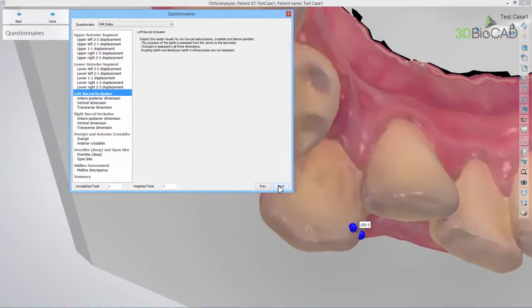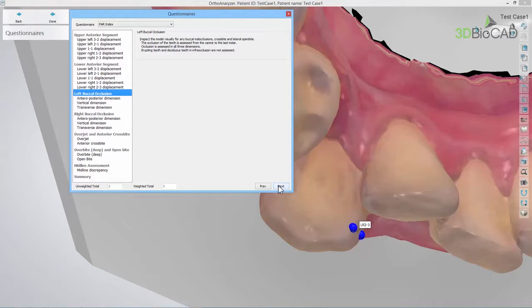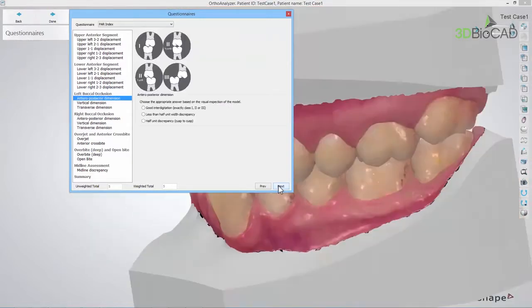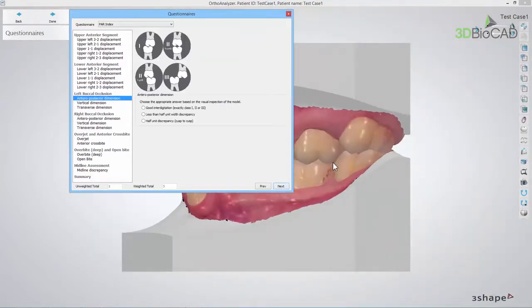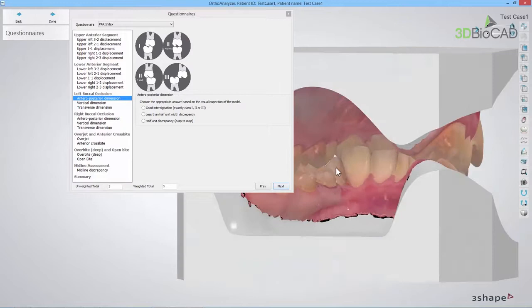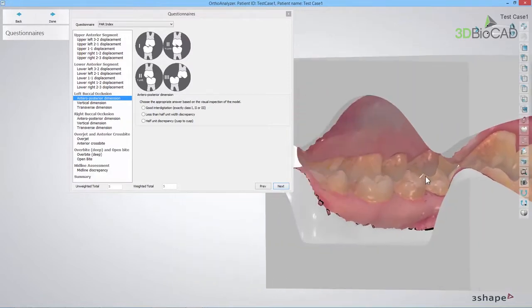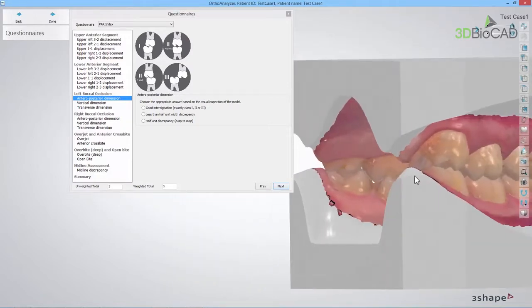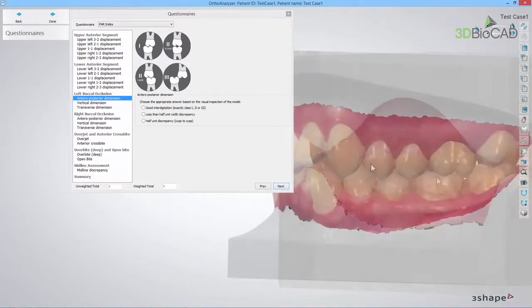In the Left Buccal Occlusion section, you should inspect the model visually for any buccal malocclusion from the canine to the last molar. The first step is the Anterior Posterior Dimension, where you should look for occlusion class. Inspect the model and choose the appropriate answer.